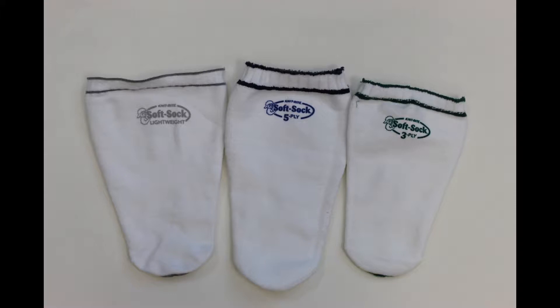Over time, your limb may decrease in size due to muscle and tissue atrophy. Throughout the day, using a pin locking prosthesis will also push fluid out of your limb, decreasing the volume of your limb. Socks replace this volume loss and prevent discomfort. It is not uncommon when using a pin locking prosthesis to stop throughout the day and add socks.